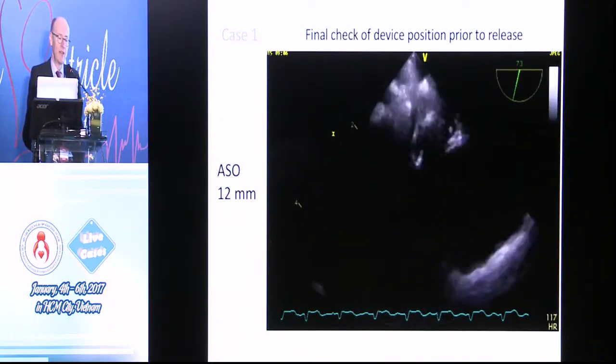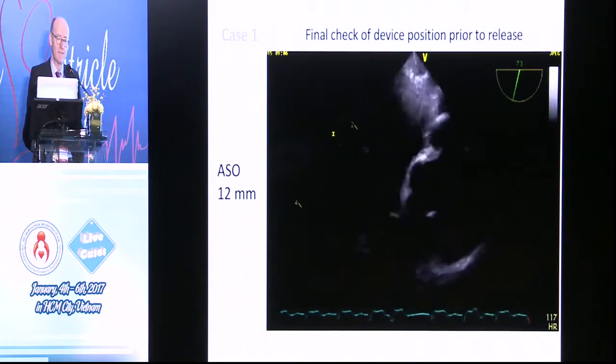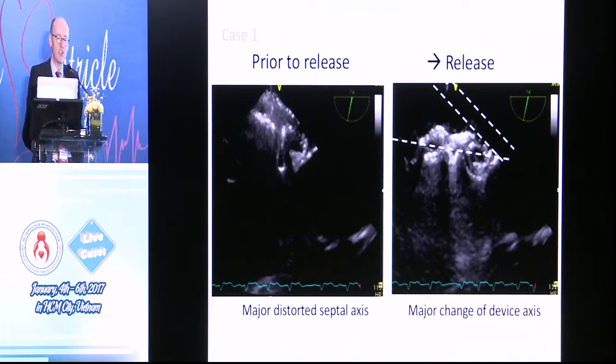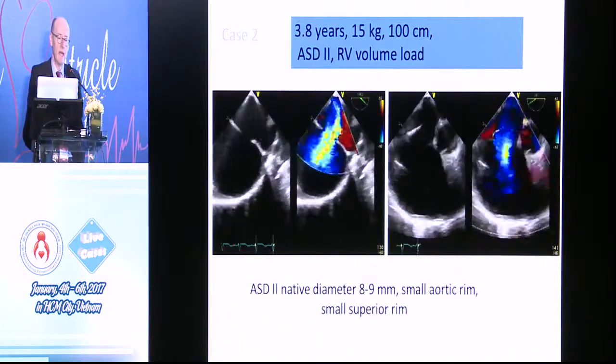So this is a 12-millimeter Amplatser septal occluder checking the device position prior to release. We're pretty much all familiar with this. We can see the change in angulation — you can see it beforehand and what it's like afterwards on these frames. And the final result, of course, is very good.